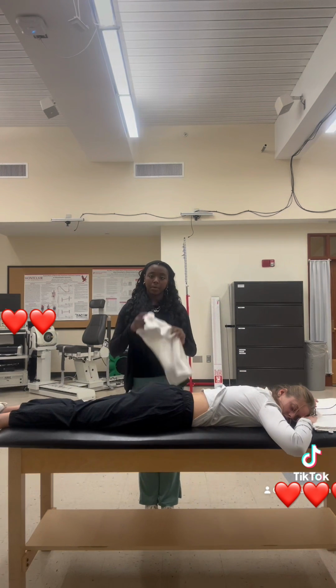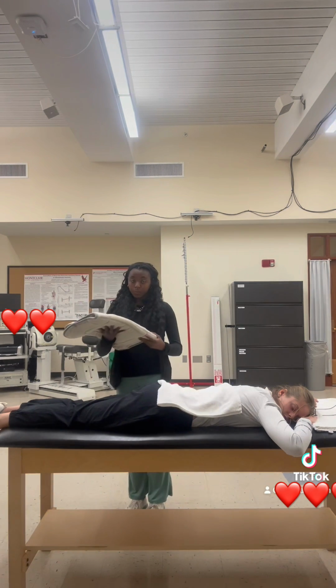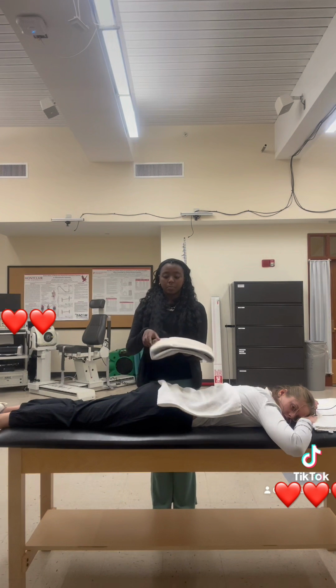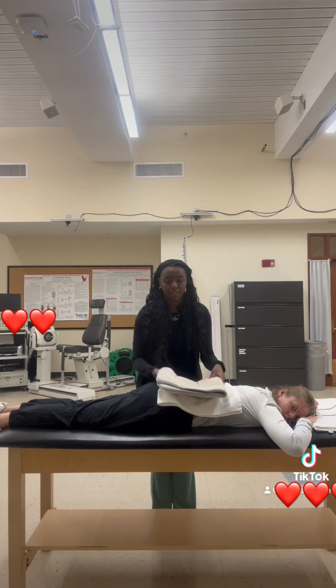Before placing the heating pad, we will place a towel in order to prevent burning of the skin and for comfort. And then we will place the heat pad. This is placed inside of either a terry cloth or another towel, despite the towel on top of the skin, also to prevent patient burning.